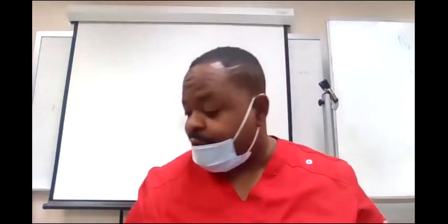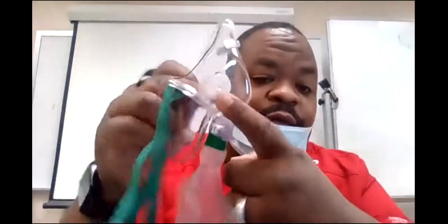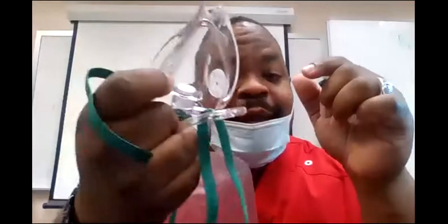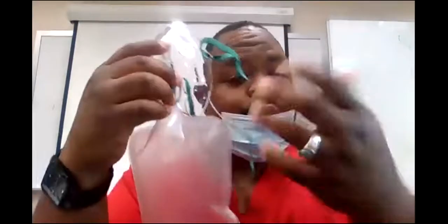Okay, we're back from break, and I'm about to show you this right quick, and we're gonna move on. This is a non-rebreather again. We said a non-rebreather has one-way valves on the exhalation ports of the mask. It also has a one-way valve in here between the mask and the reservoir bag. The liter flow for the non-rebreather and the partial rebreather are both 8 to 10 liters, okay? Unless the patient's bag totally deflates on inspiration. If that happens, then you increase the flow.